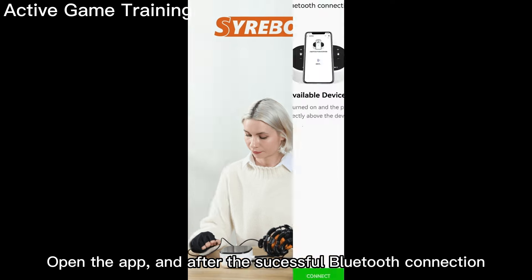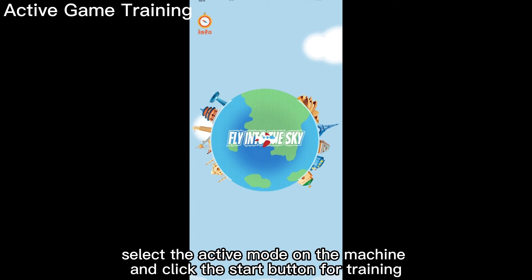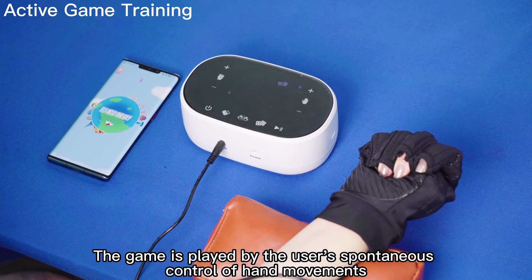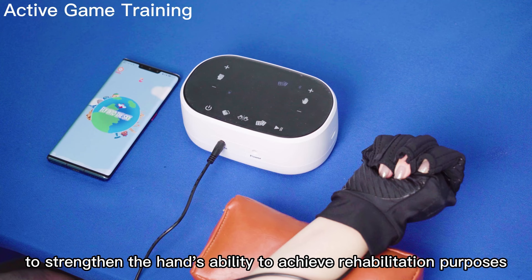Open the app, and after a successful Bluetooth connection, select active mode on the machine and click the start button to begin training. The game is played by the user's spontaneous control of hand movements to strengthen the hand's ability and achieve rehabilitation purposes.